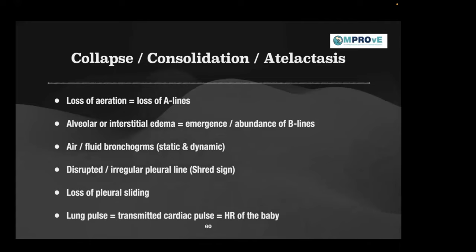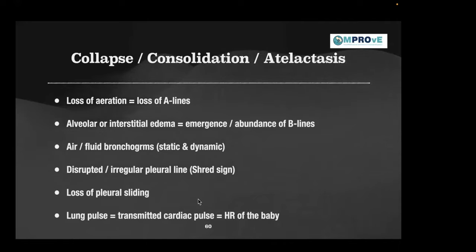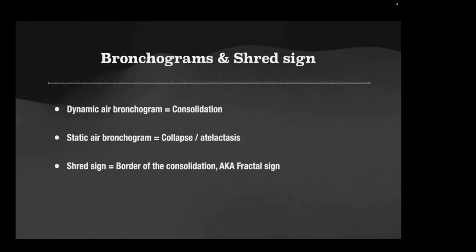And there is something called lung pulse. It is not pleural sliding. It is just a transmitted cardiac pulse. And the good way to differentiate this from the pleural sliding is it will always be equal to the heart rate of the baby. So you can see the lung pulse and I can see the heart rate on the monitor, and you can come to a conclusion that this transmitted pulsation is from the heart of the baby.